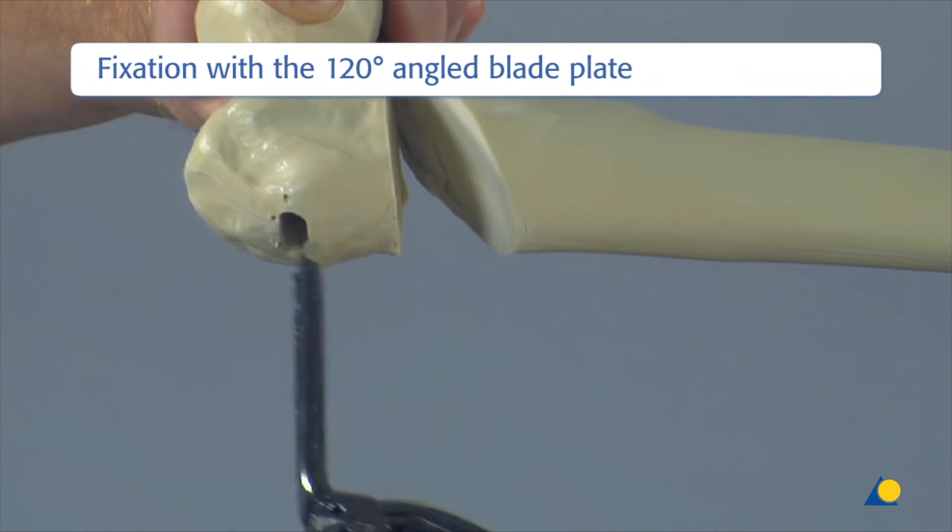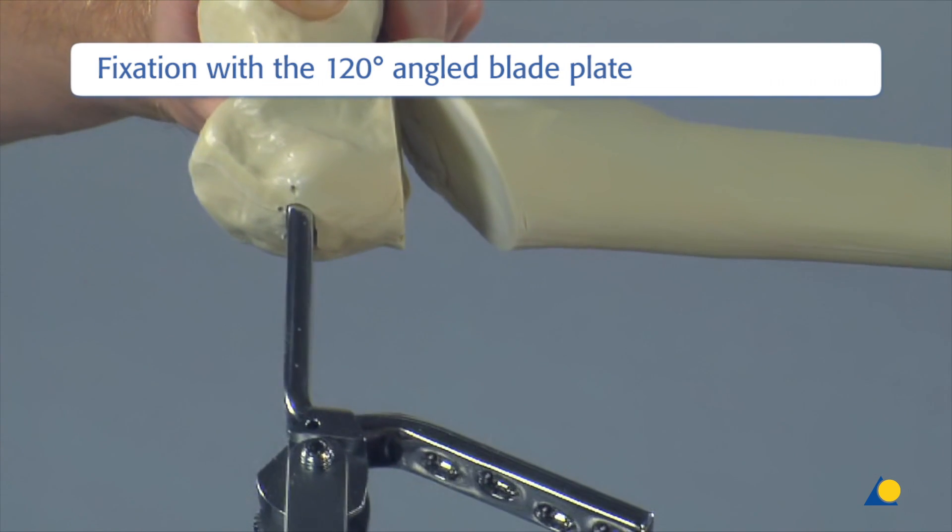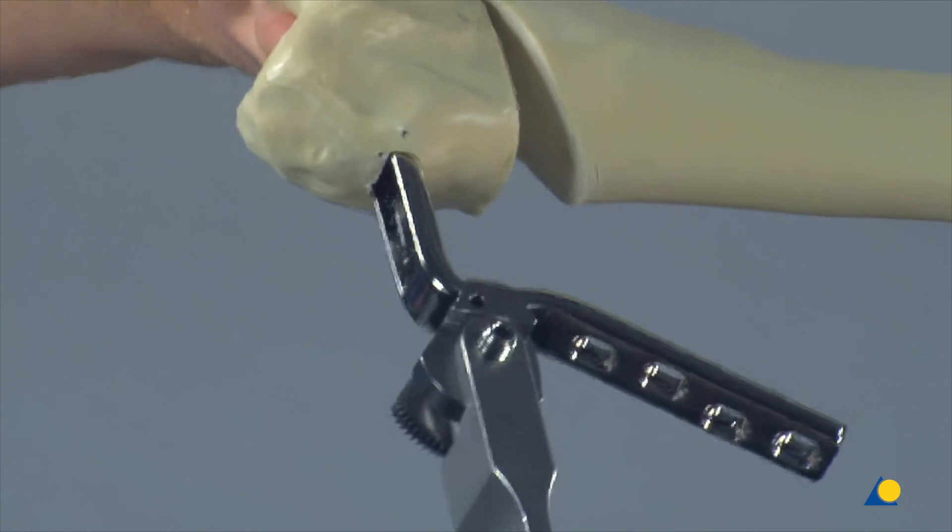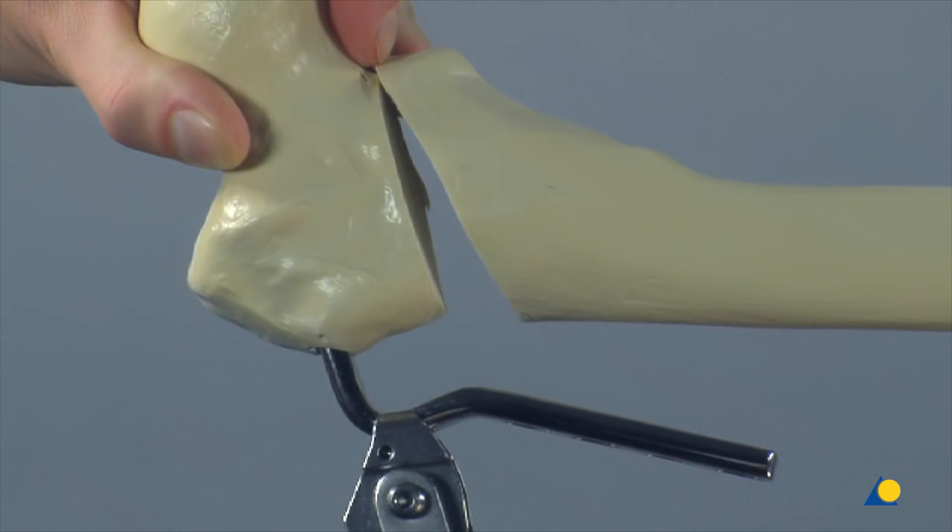After the osteotomised bone wedge has been removed, the 120 degree angled blade plate is inserted, leaving it laterally one centimetre proud of the bone.